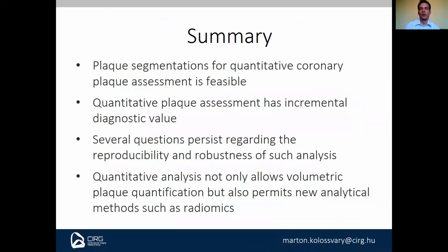So to sum up, we can say that plaque segmentation and quantitative coronary plaque assessment with QAngio CT is feasible. The quantitative plaque assessment and volumetric analysis of different plaque components has an incremental diagnostic value as compared to simple qualitative clinical reading. But still, there are several questions that need to be addressed for us to receive reproducible and robust results in the future.